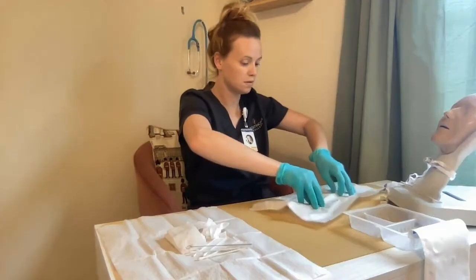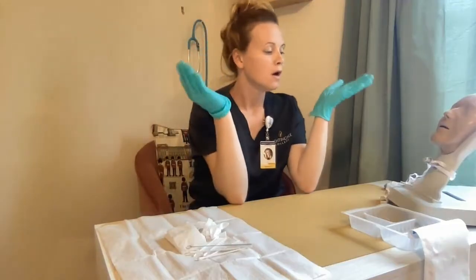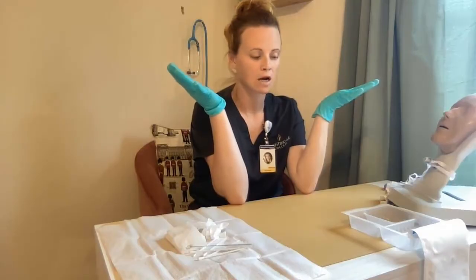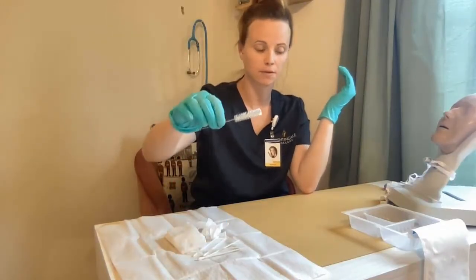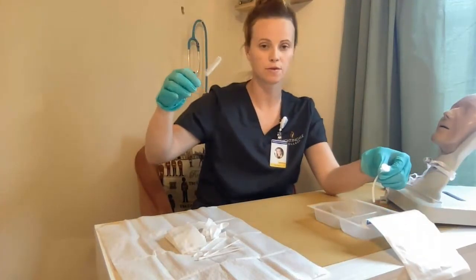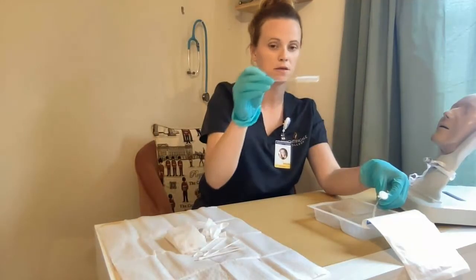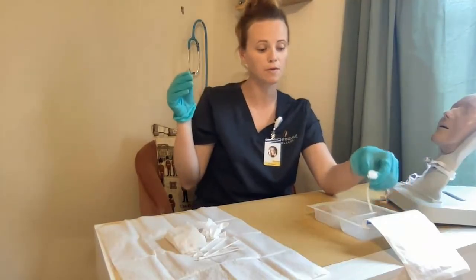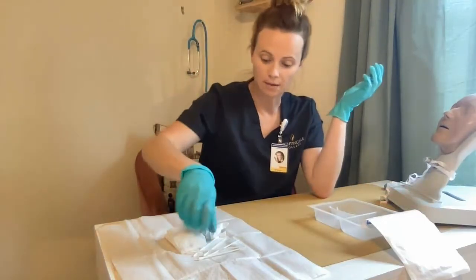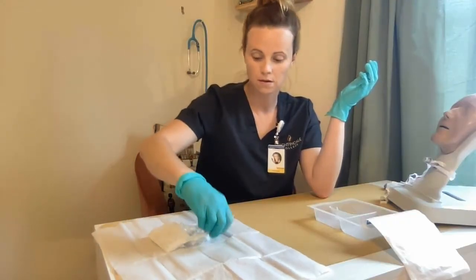Thumb out. I can remove the packaging by grabbing the inside here, and dispose of that. Next, I want to clean my inner cannula. I'm going to cover the sterile field with my sterile hand, grab the brush, and pick it up. I'm going to pick the inner cannula up with my — so to speak — dirty hand, and then clean the inside of the cannula and all around. Dispose the brush, and then place the inner cannula in the saline-only area.